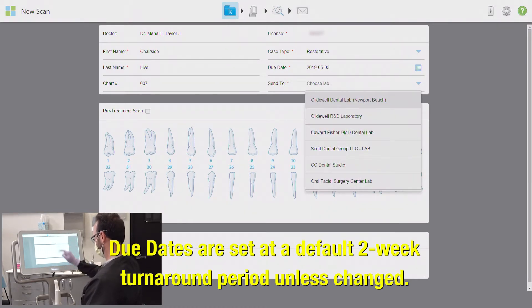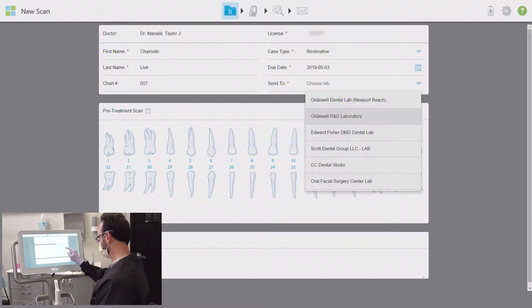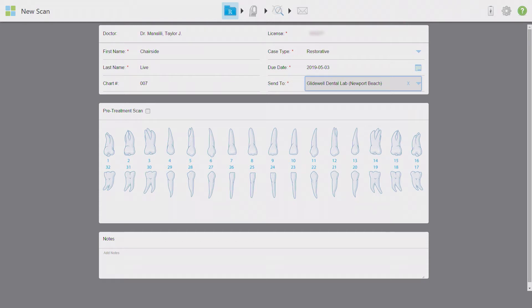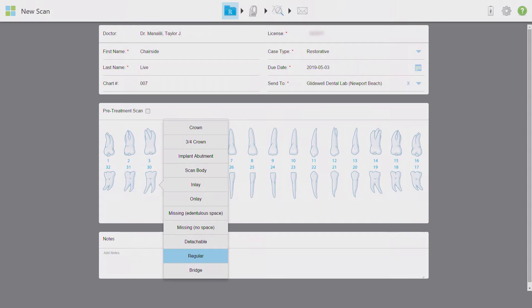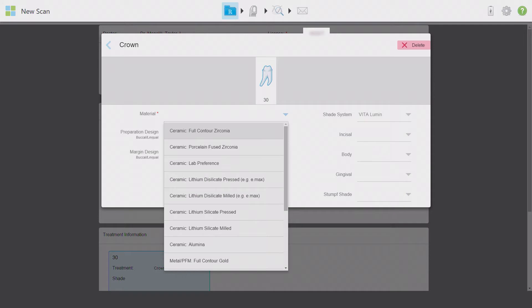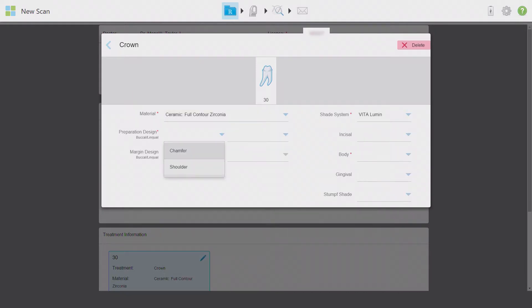The iTero will automatically suggest and highlight a two-week turnaround time unless you specify a rush case and change the due date manually. Under the send-to menu, select the lab this will be delivered to — today this scan will be headed to my home base, Glidewell Dental Lab in Newport Beach, California. I'm going to give as much information as possible in the prescription portion. I'll select the tooth in question and click on the appropriate restoration — today is a full coverage crown. My doctor is requesting a Bruxer aesthetic solid zirconia restoration.